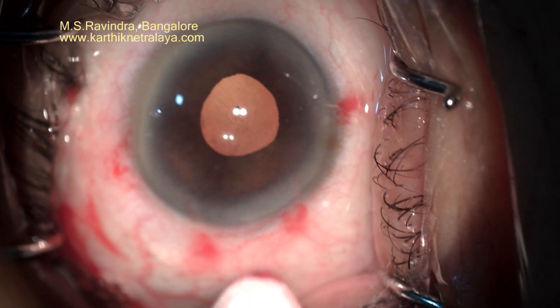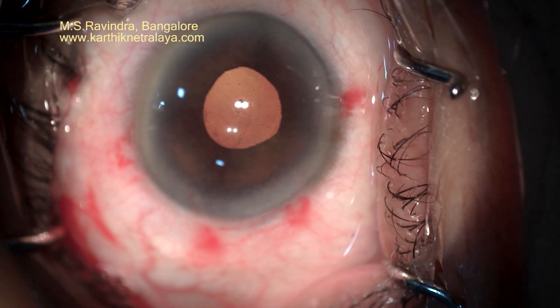The post-op follow-ups and visual recovery are similar to any other case, and corneal or retinal problems are highly insignificant.